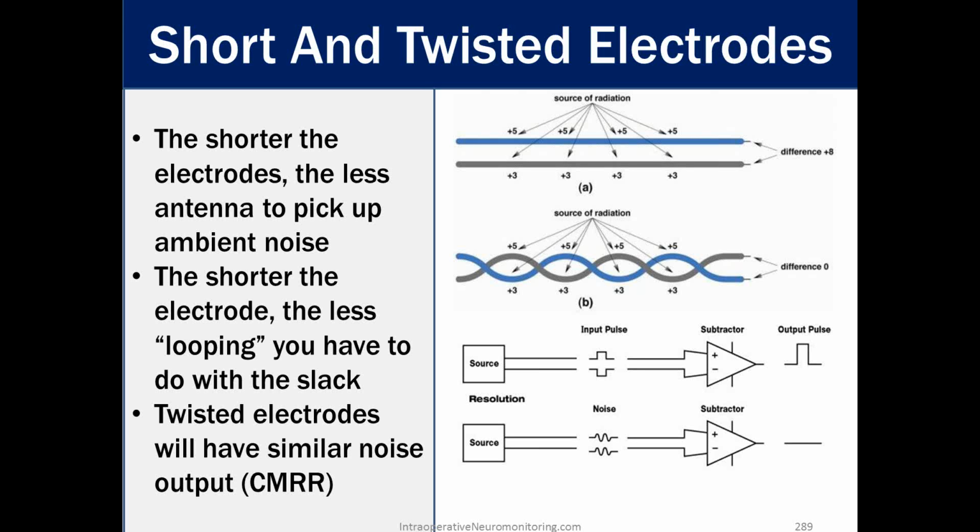And in the picture below that, we see source 1, the positive, has that upgoing wave. Source 2, or the inverting, the negative side, has that downgoing wave. And the output is, after the negative is inverted, it's additive to the non-inverting positive, and we have that large amplitude.